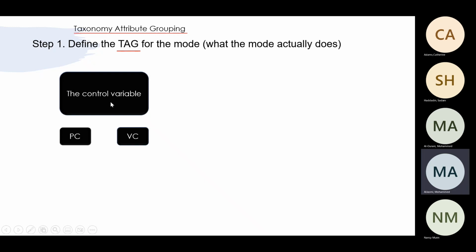So the control variables, we said we control pressure or we control volume, is that right? That's the control variable. If I'm controlling volume, Ramsha, is the flow constant or can it be changed? Feel free. Constant. We can put the flow as constant, and I cannot touch it. The patient cannot do anything with the flow during inspiration, is that right? Because we say it's volume control, actually it's flow control, okay?